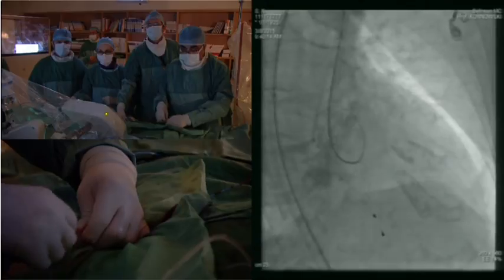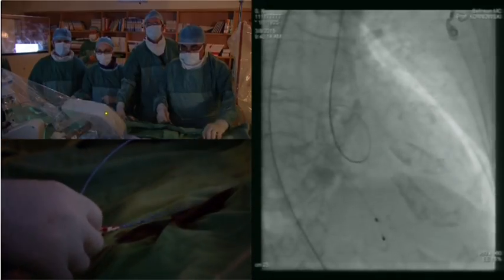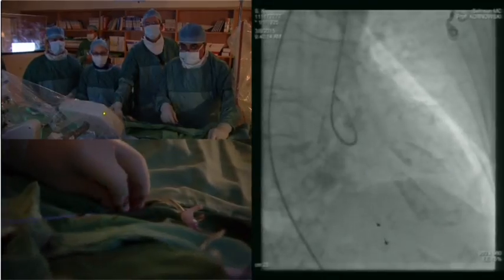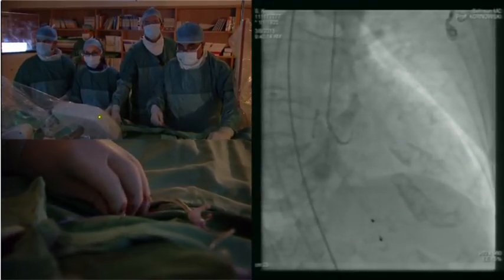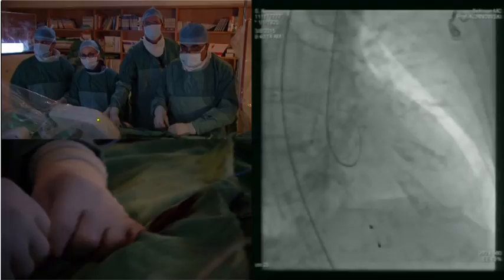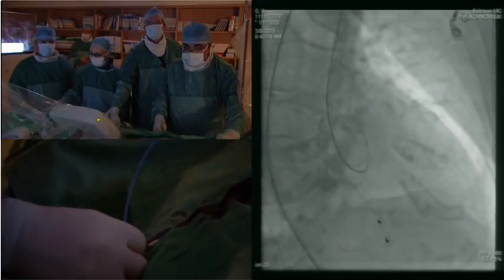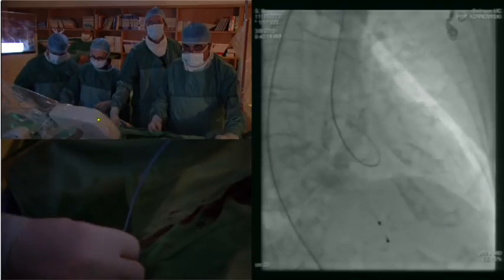Ran, this is 035 or 038? Hello? It's a 035 wire. The exchange code. The exchange.